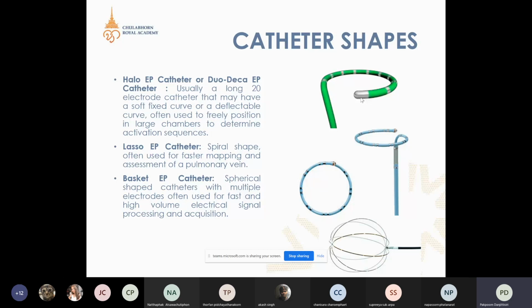About the activation sequences in the case of atrial flutter ablation, to see the blockage of the line of ablation, or to see the activation sequence from the atrial flutter that tries to spread out to the right atrium. Okay.